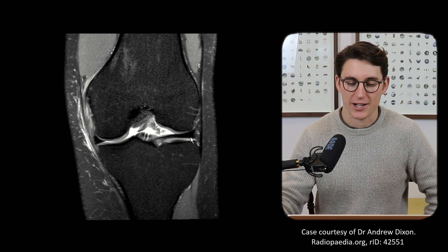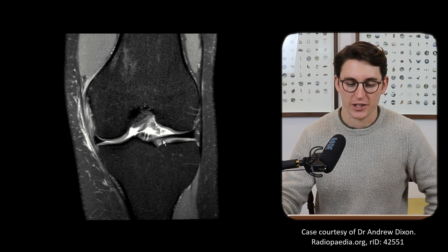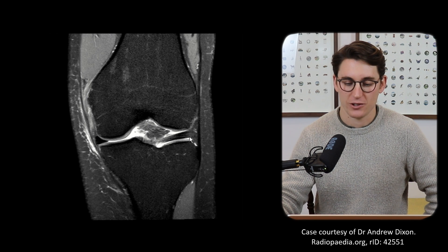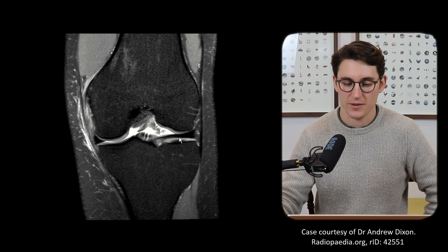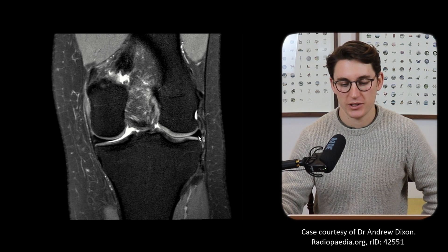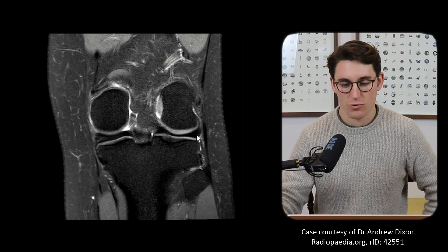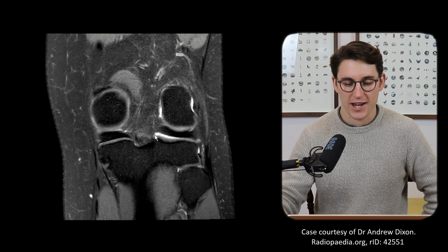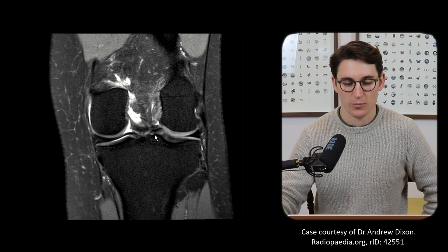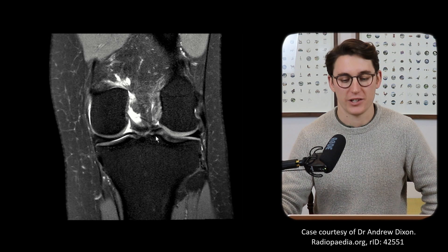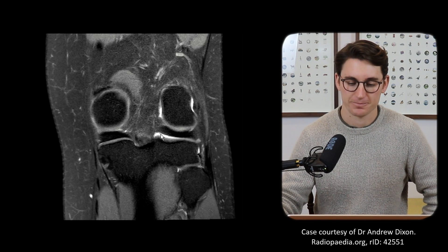Let's look at our lateral meniscus. Starting anteriorly, we can see our anterior root coming into our anterior horn, going back into the body of the lateral meniscus, round to the posterior horn of the lateral meniscus, and attaching more medially as our posterior root of that lateral meniscus.